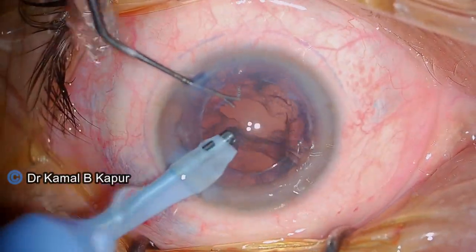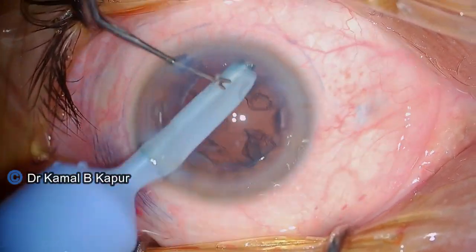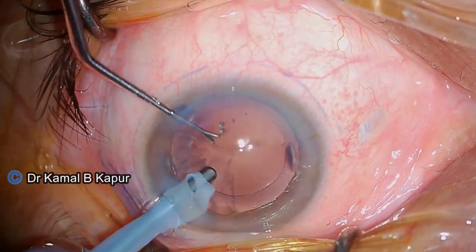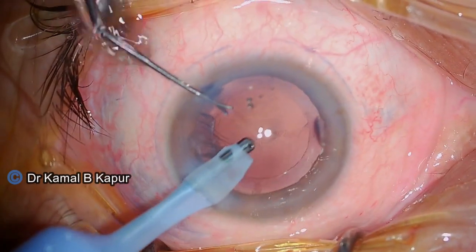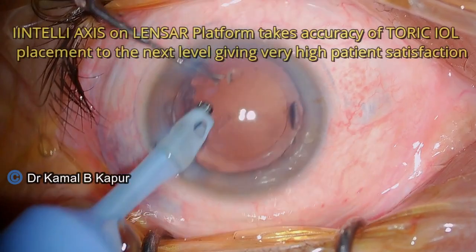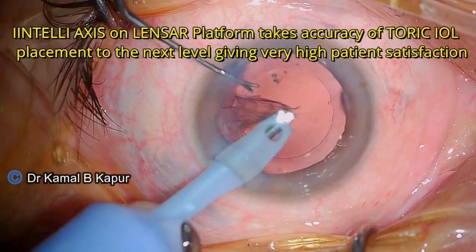Now we proceed to do irrigation aspiration. Irrigation aspiration in a femtolaser case can at times be tricky, especially in the subincisional area, due to lack of approach and a slightly sticky cortex that is cut flush with the capsule rexis margin as the femtosurgery is done.